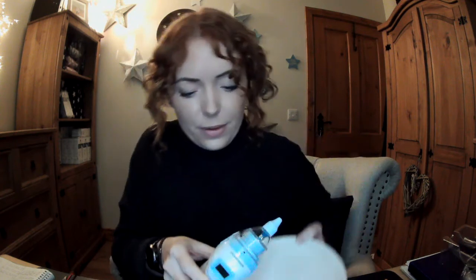So when you do it, you'll just be at the baby's nose for a couple of seconds and take it away. And we press stop there. So if you can see the little funnel, it brings it into the cup. So when you're finished, you can open it up and remove the cup. And there's all our mucus, blue mucus. Babies not very well. Anyway, there you go. So we can get rid of that one.